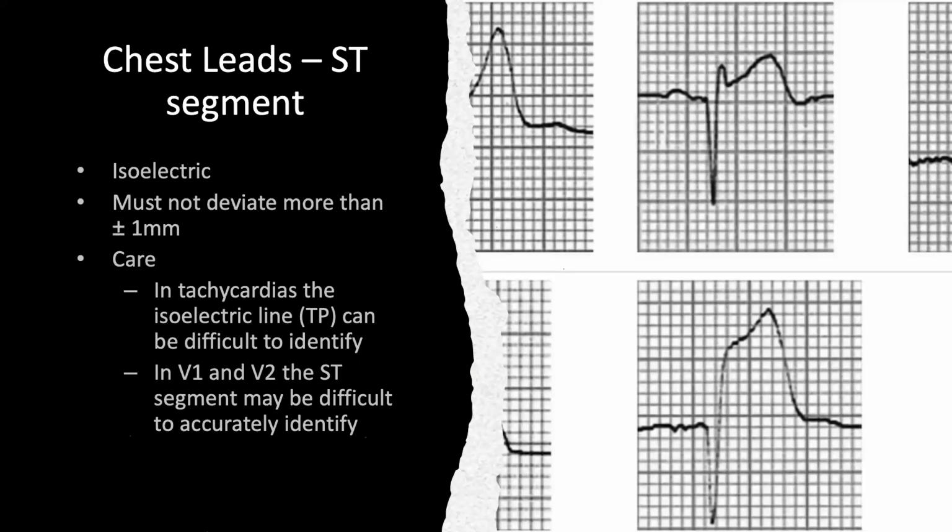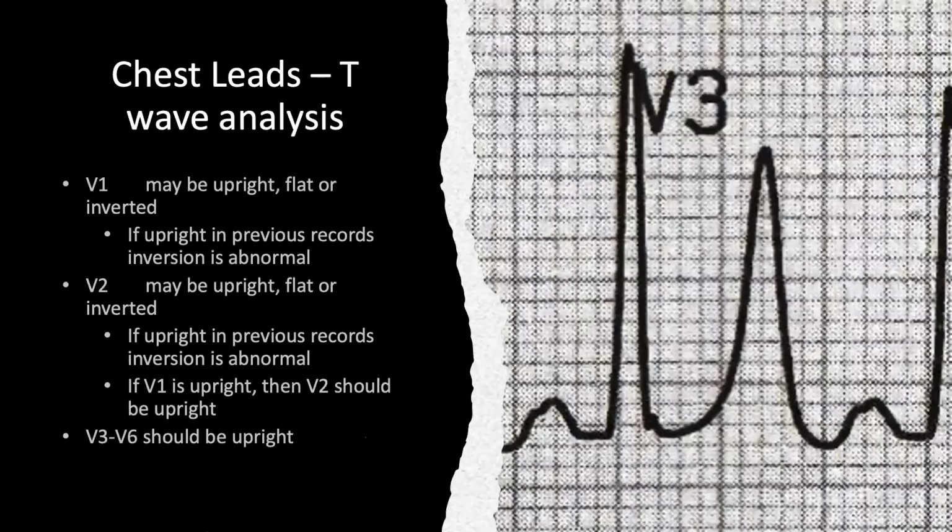The other thing, thinking about T waves. So we've got T waves there again, and different types of T waves. I've completely forgotten the name of these T waves, but these are peaked T waves. So you can get peaked T waves in a few conditions, and thinking about, what does the T wave look like? Is it a normal T wave? Is it a biphasic T wave, so it's got 2 bumps? Is it completely gone? Is it negative? And thinking about that in the context of the patient that you're seeing, what does that mean? And remembering to think about those causes.